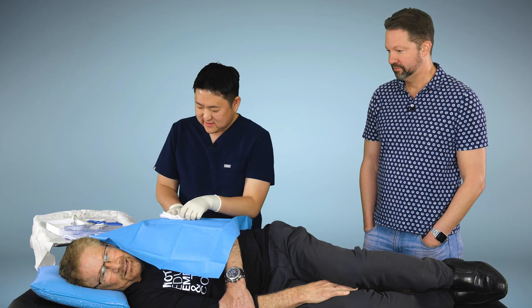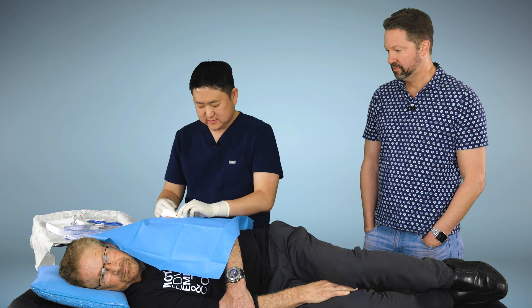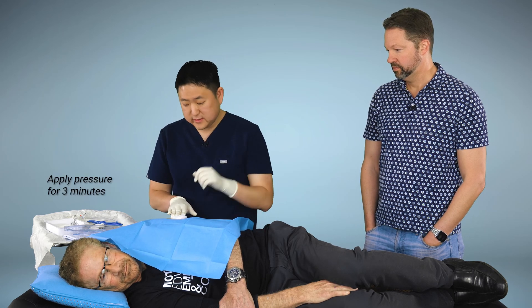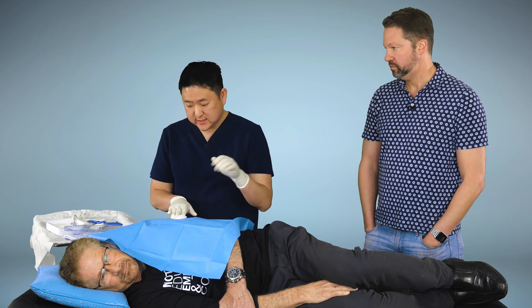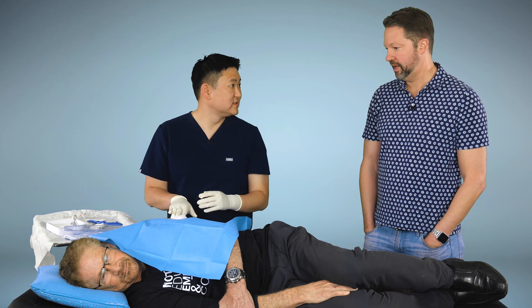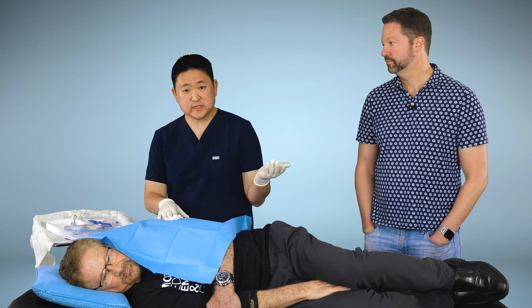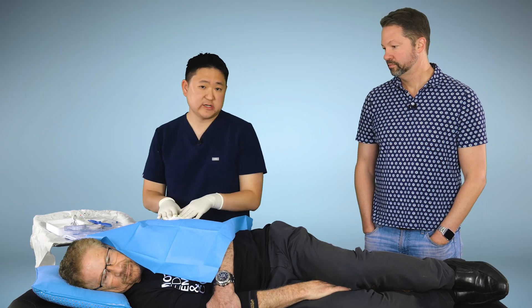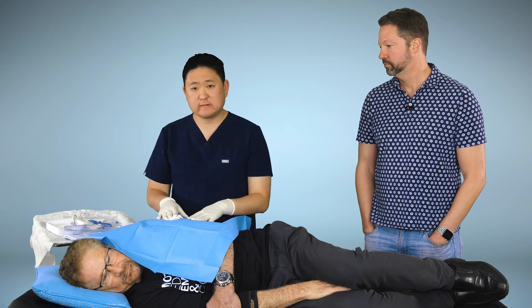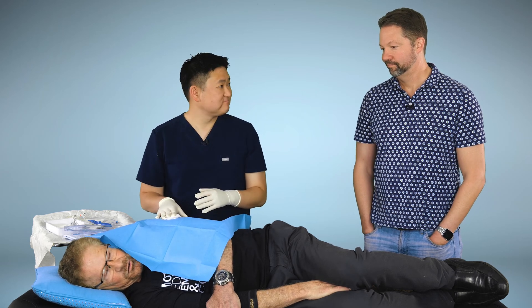We're going to put in the sensor now. This is the sensor deployer — the official term — and that's it, the sensor is already in. Did you feel anything? Not at all. We'll just apply a little bit of pressure for a few moments, then put on the steri-strips — what I call the band-aids — and the procedure is already done. Most patients are shocked when they hit this point — they say, 'Wow, you're already done!' We'll just put on some steri-strips and then sit you up and talk about aftercare.